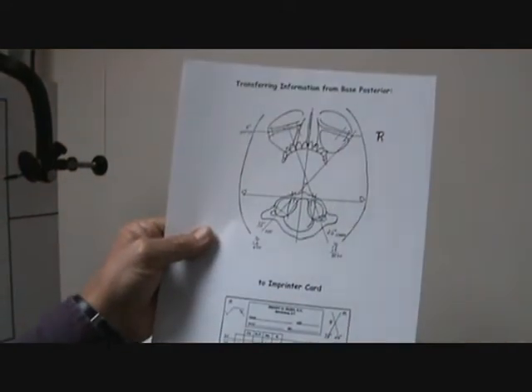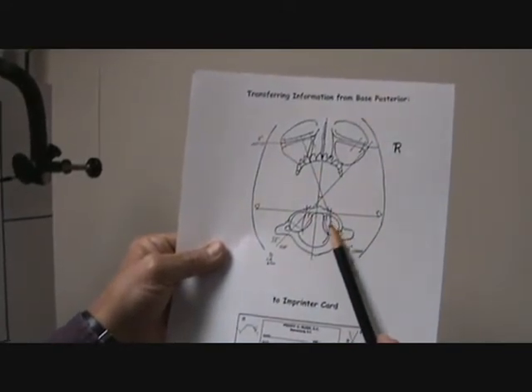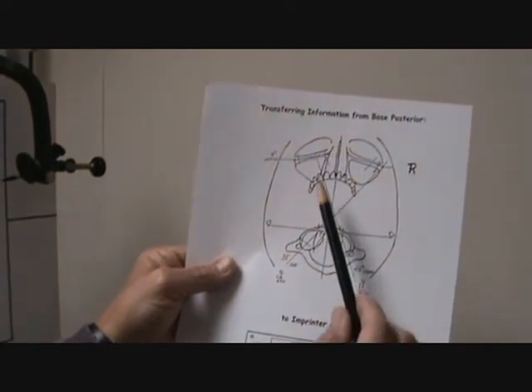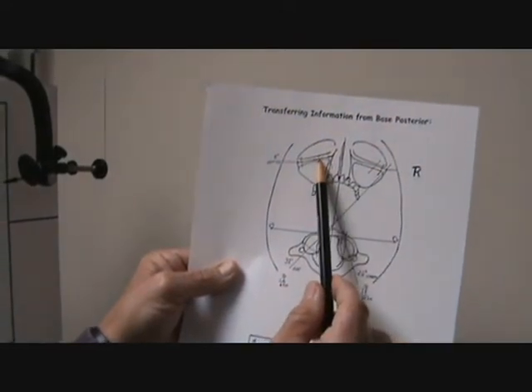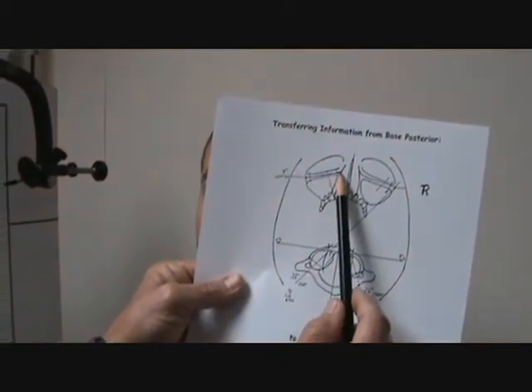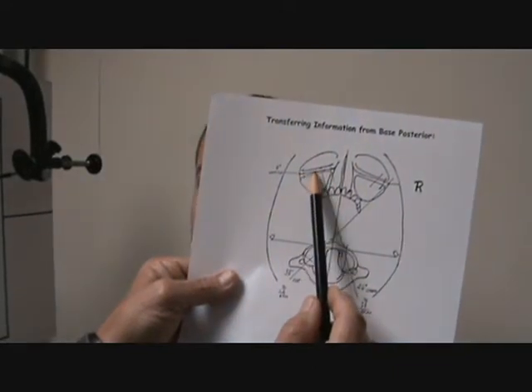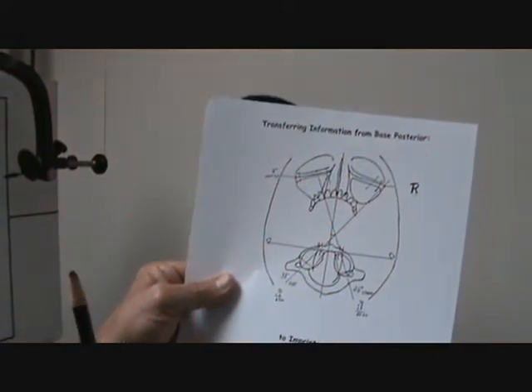I'll be demonstrating how we arrive at that vertical collimator point at another time. When we shoot through the right condyle — or the right superior articular surface of Atlas — we're going to go through the left orbit. Where that condyle line passes through the orbit is where we want to mark a dot where the vertical collimator crosshair has to go. So I'm going to demonstrate how we find the medial and lateral aspect of the orbit, divide it in two, and come up with exactly where to put that dot.